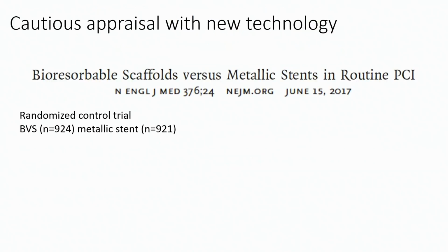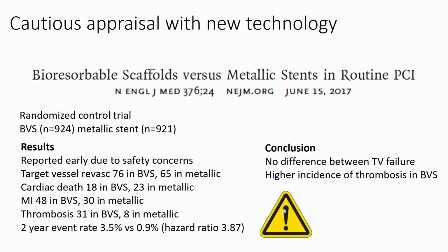However, along the lines of new technology, we have to be very cautious. I talked about the bioabsorbable vascular scaffolds, and I said I'd come back to it. It's a very novel concept, because it provides temporary mechanical support while it's needed, and then the stent is supposed to disappear completely to remove the foreign body and get rid of that reaction of stent thrombosis provocation. However, in this study, they looked at a randomized control trial comparing bioabsorbable vascular scaffolds with metallic stents. And these results were reported early because of safety concerns.